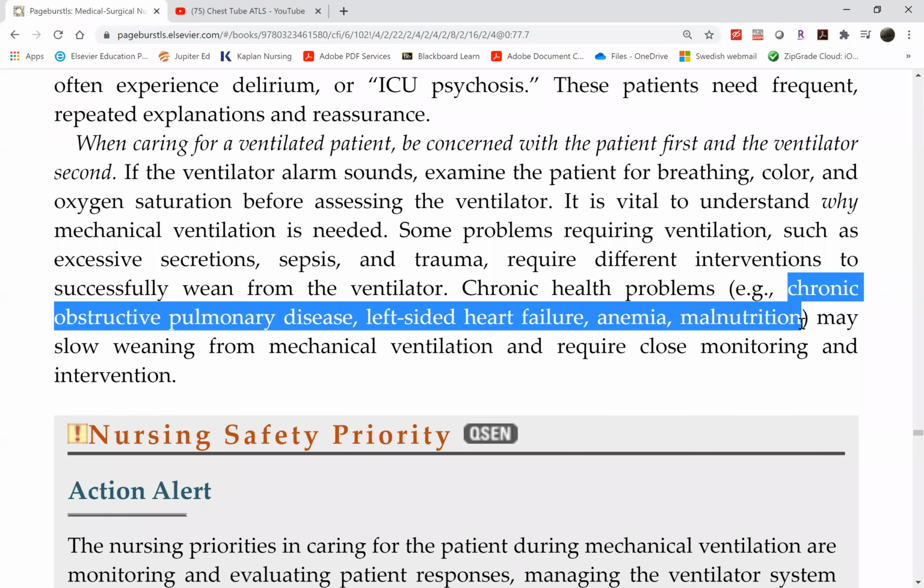That proved to be very impractical, because imagine if you have to clean stool, for instance, or assess the patient's lung sounds, then you have to interrupt the therapy, open the cylinder and do your thing, and then do the whole thing over again. The alternative was like a suit. It looked like a body bag, but same thing, the patient's head is sticking out, the rest of the body is inside a body bag. That was also a negative pressure ventilator, so you can easily see that didn't work out very well. So they got rid of that, and now all our ventilators are positive pressure ventilators.